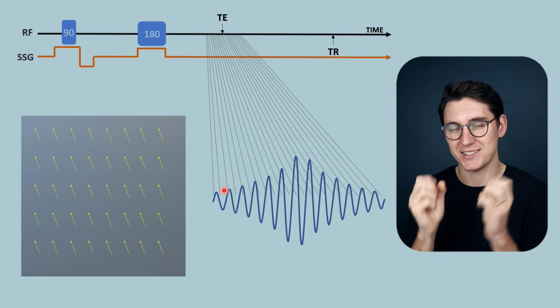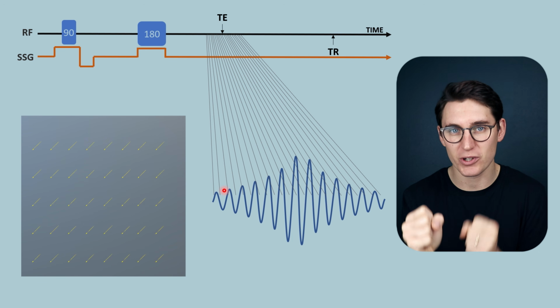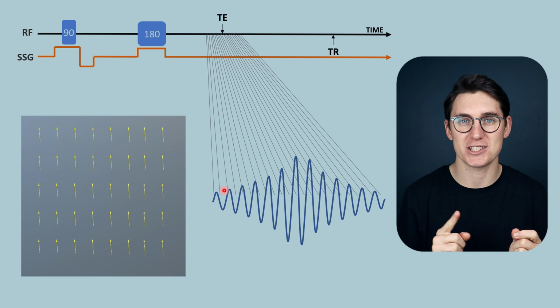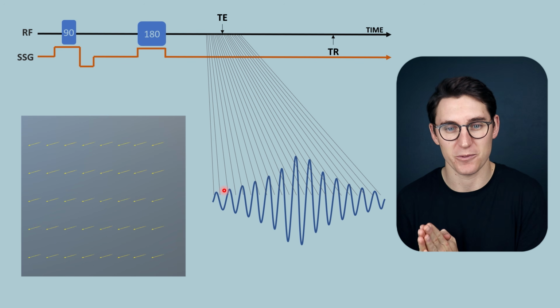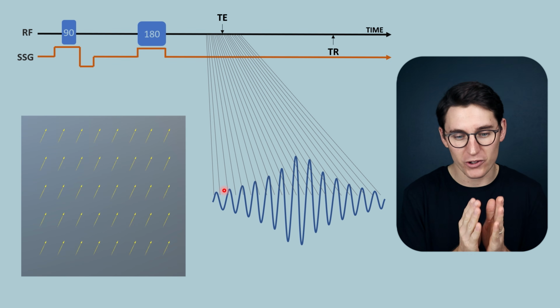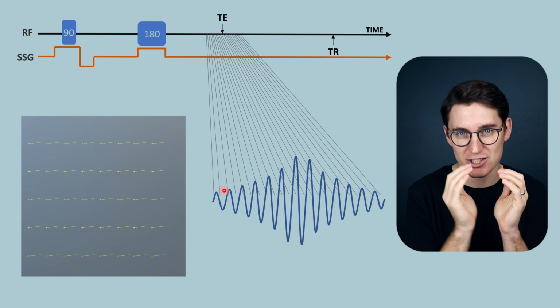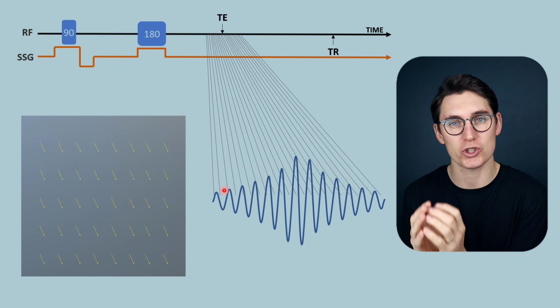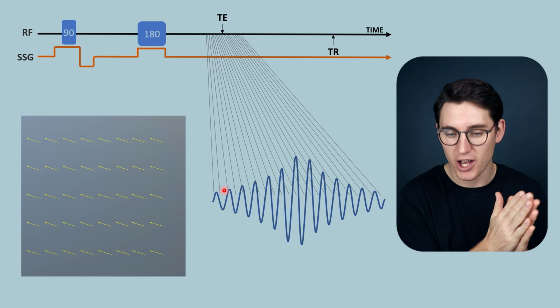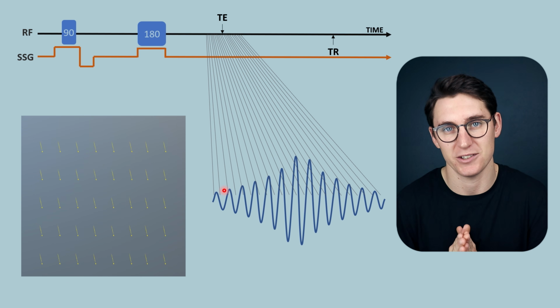Now, when we talk about digital values, we're talking about discrete values over a period of time. We need to convert that analog signal into a digital signal. And each point that we sample that analog signal, we are creating a digital signal, a discrete value that we can enter or store in the computer. And we'll be getting multiple discrete values across a period of time with this signal.